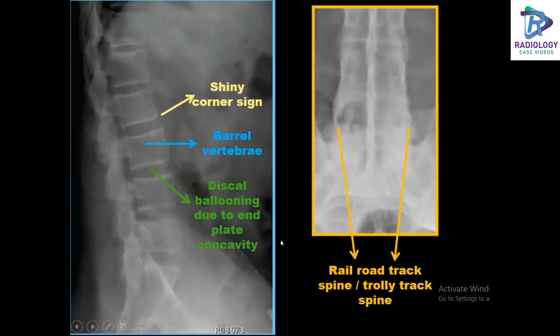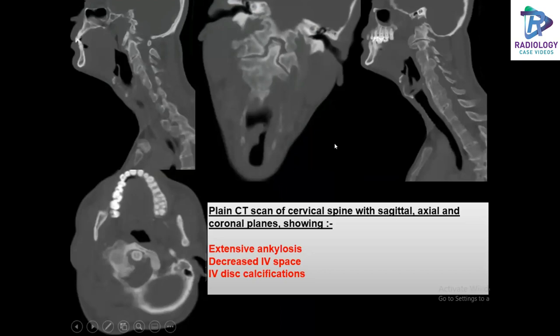Lateral and frontal radiographs of the spine showing the shiny corner sign, barrel-shaped vertebrae, discal ballooning due to end plate concavities, and the railroad or trolley track spine. Plain CT scan images of the cervical spine in sagittal, axial, and coronal planes in bone window show extensive ankylosis and decreased intervertebral disc spaces.